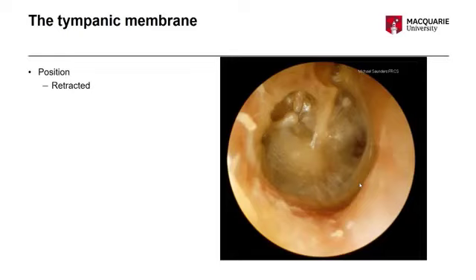Now, depending on how long this persists, it can resolve spontaneously, or it's something that might require treatment. Again, this might be quite painful, but there's no inflammation, so it doesn't appear red, but that doesn't actually mean that it's not painful for the client.